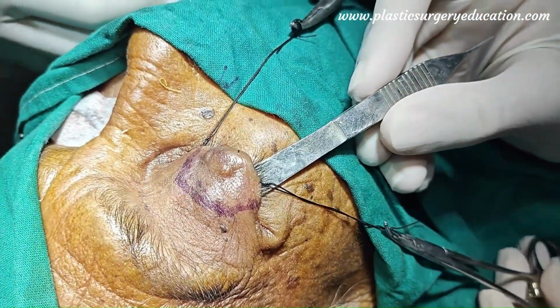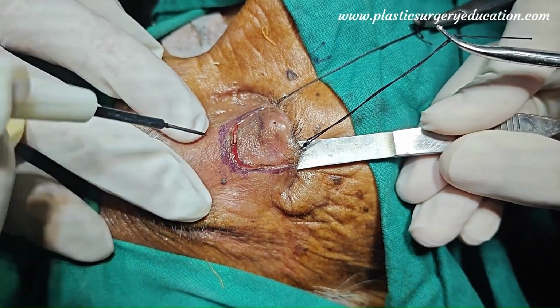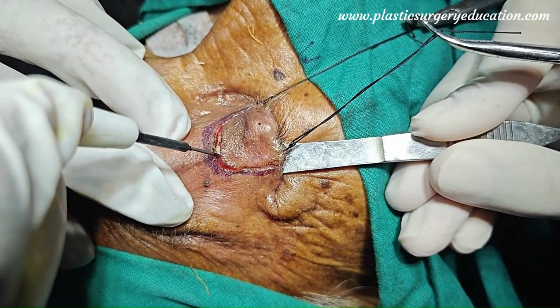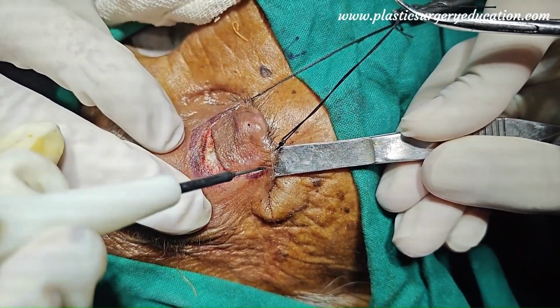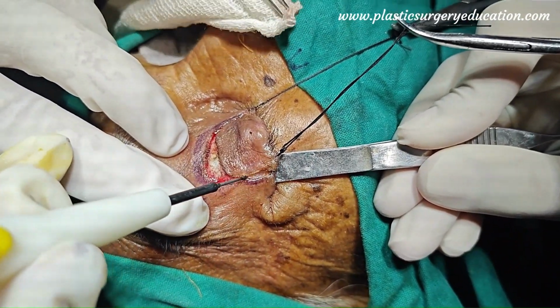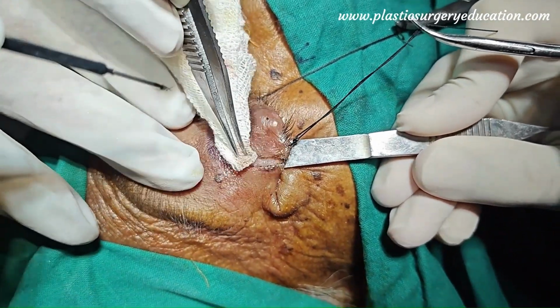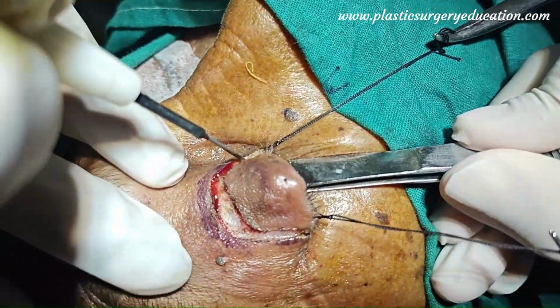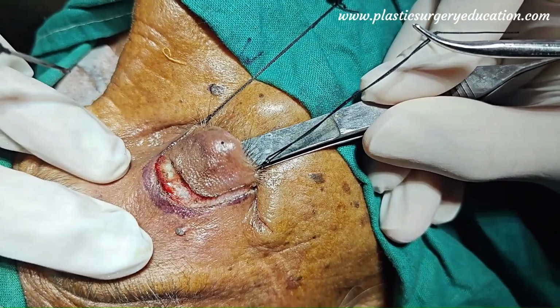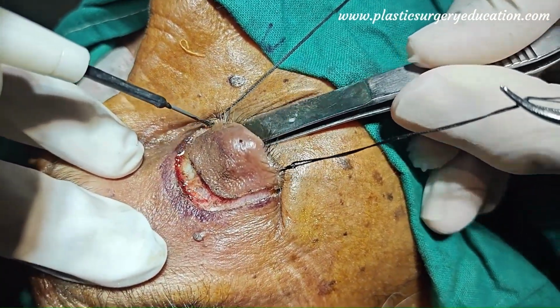So till we do the wide local excision, let us discuss the options we have for near total upper lid reconstruction. Now, conventionally, we have two options. One is the Cutler beard flap, and the second one is the Mustarde's lid switch flap. We already have a video of the Cutler beard, and this is showing the Mustarde's lid switch flap.